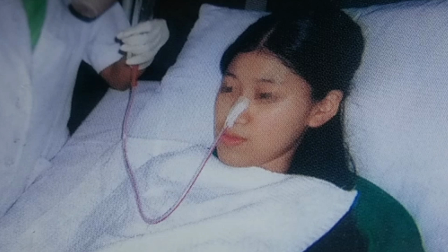If tube placement is confirmed in the stomach, pinch the feeding tube and attach the syringe of feeding to the tube. Once the placement is confirmed in the stomach, we pinch and attach the syringe. After attaching, we take the fluid above the head level. Why above the head level? That is the gravity. Easily it will go inside the patient's stomach without any disturbance. So pour the feed into the syringe and allow it to flow by gravity. Don't pour too fast, don't pour too slow. Slowly send the feed inside the tube, keeping that level above the patient's head. After feeding is completed, flush the tube with at least 20 ml of plain water.